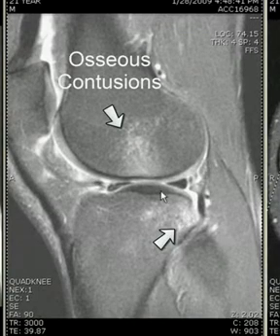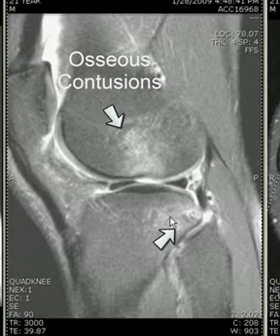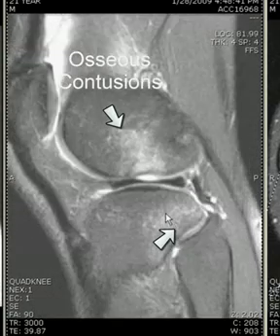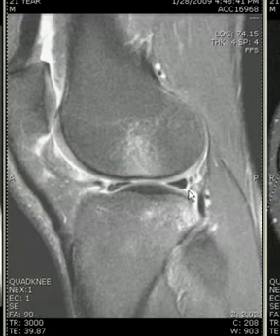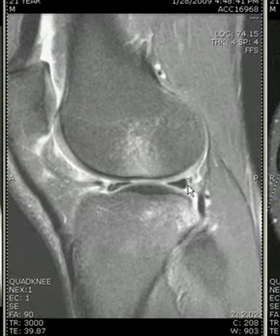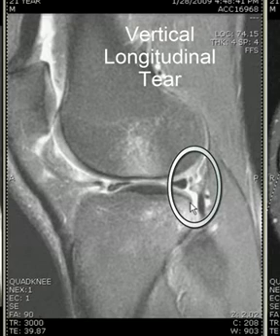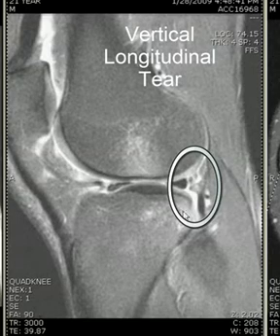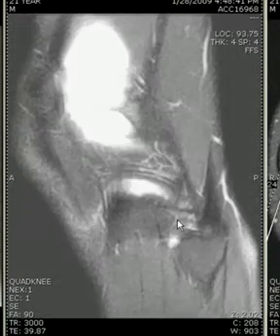The typical pivot shift bone contusion pattern is seen in the lateral femoral condyle and the posterior tibia. In addition, if we look at the lateral meniscus, we can see a subtle area of vertical linear signal touching the superior and inferior free edge. Posterior to this is some intact normal meniscus, so this represents a vertical longitudinal tear.